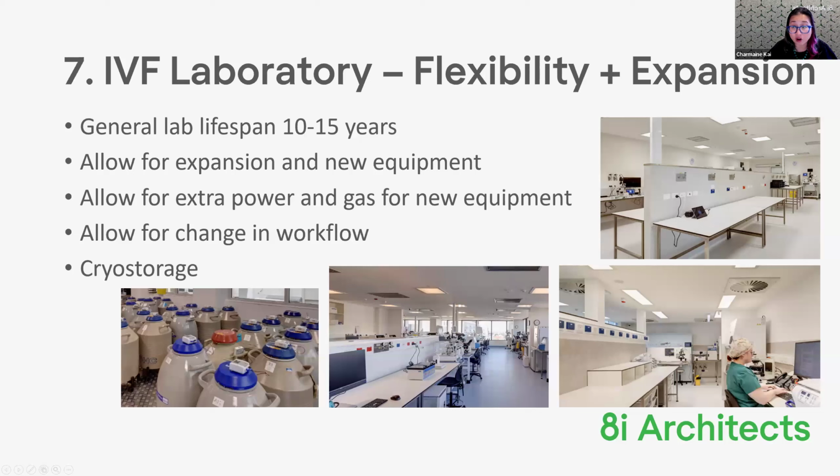So if it's well designed, your lab should need absolutely minimal refurbishment during that 10 to 15 years. And if you've done all these things that we've talked about, future proofing and planning and allowing for growth, generally you should be able to do basically nothing to the lab until the end of that 10 or 15 years. So definitely consider expansion, and not just a little bit.